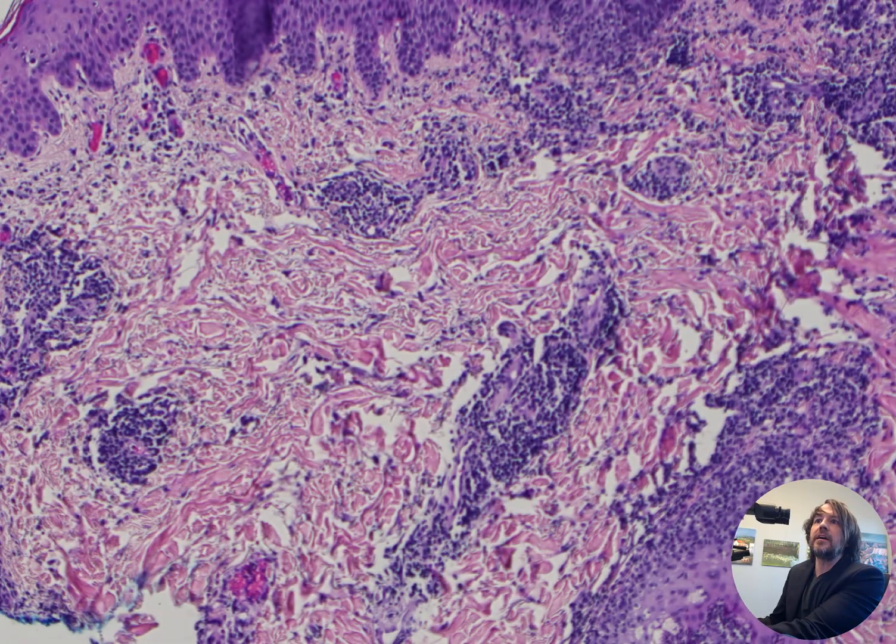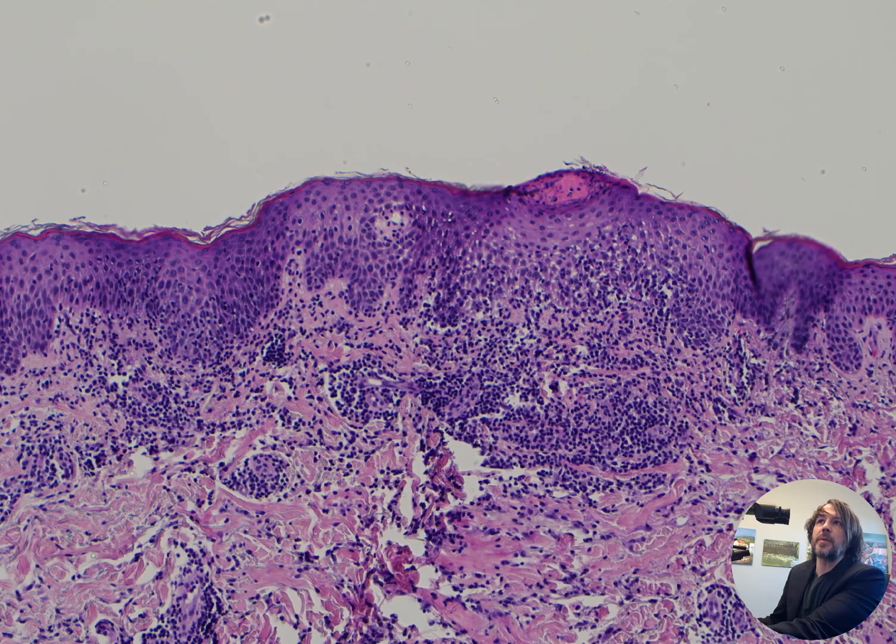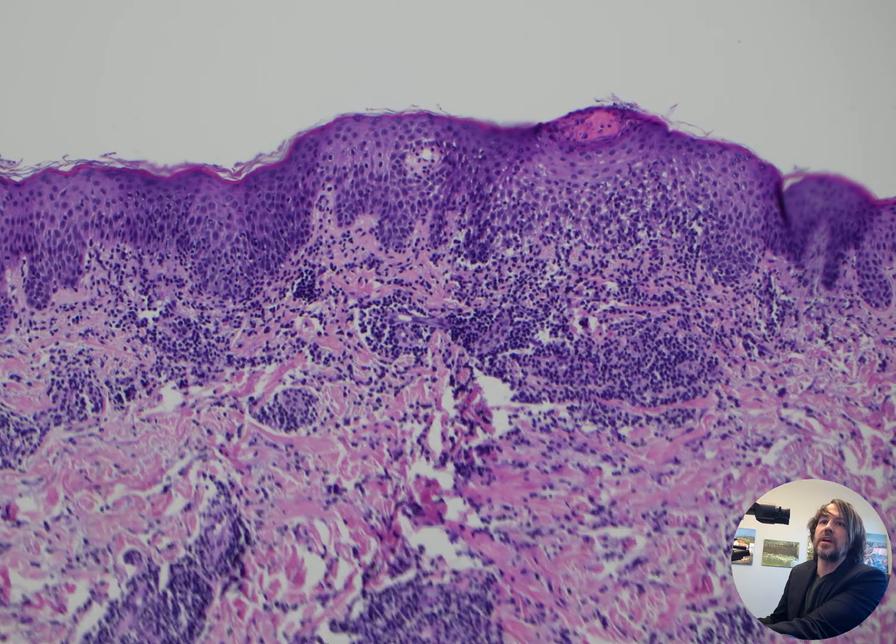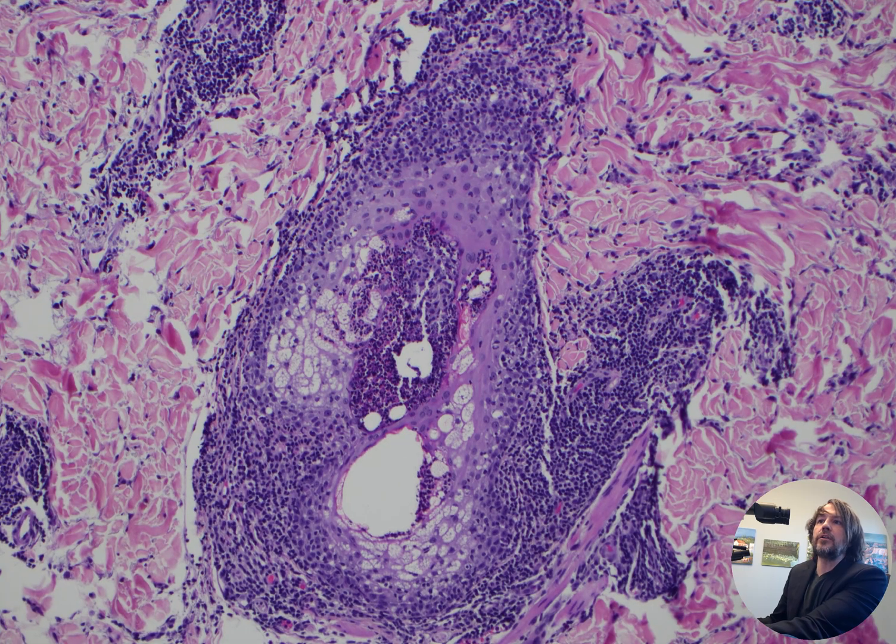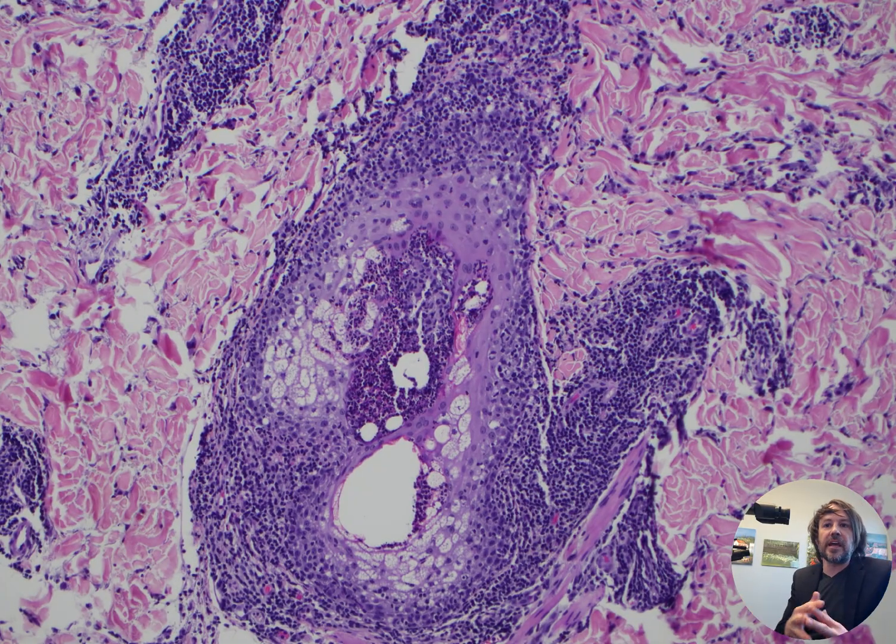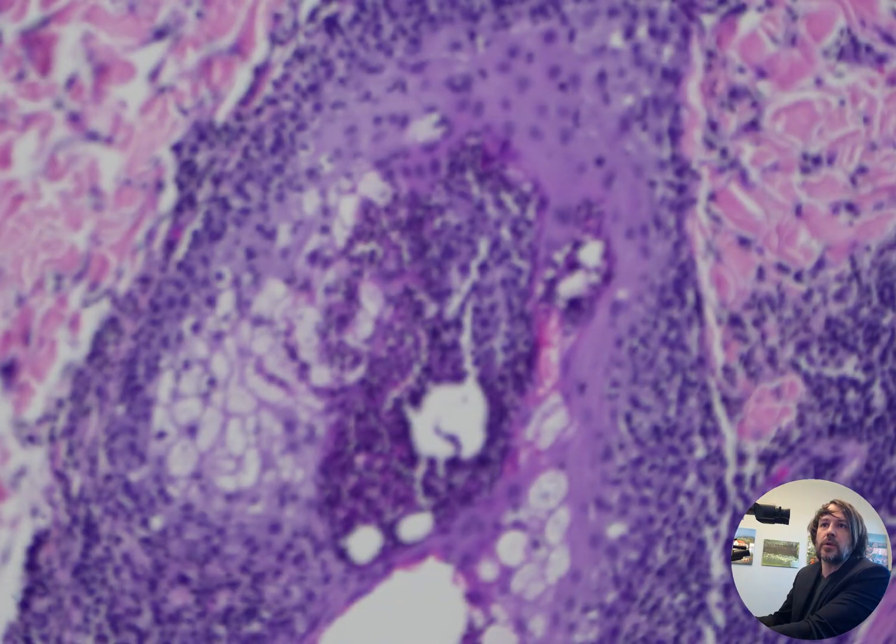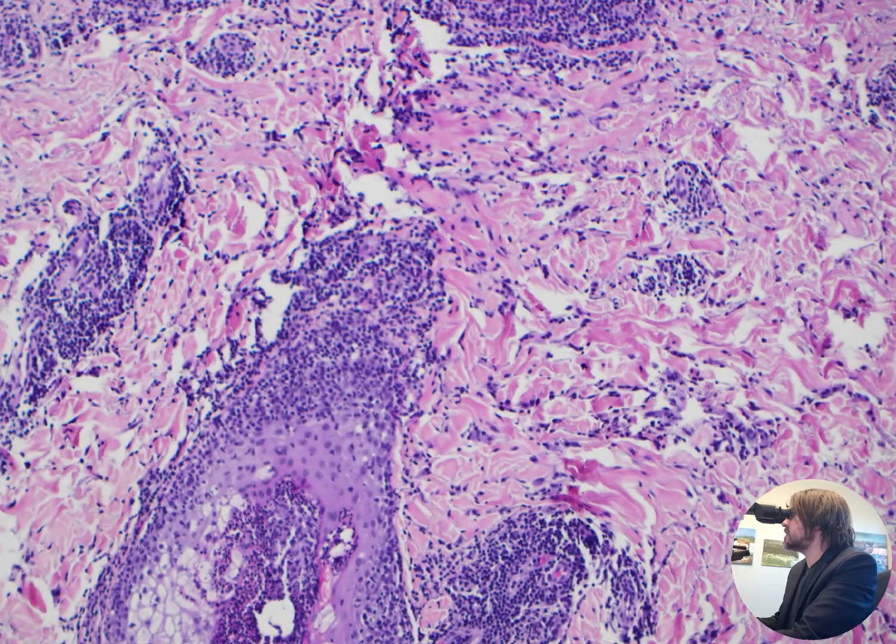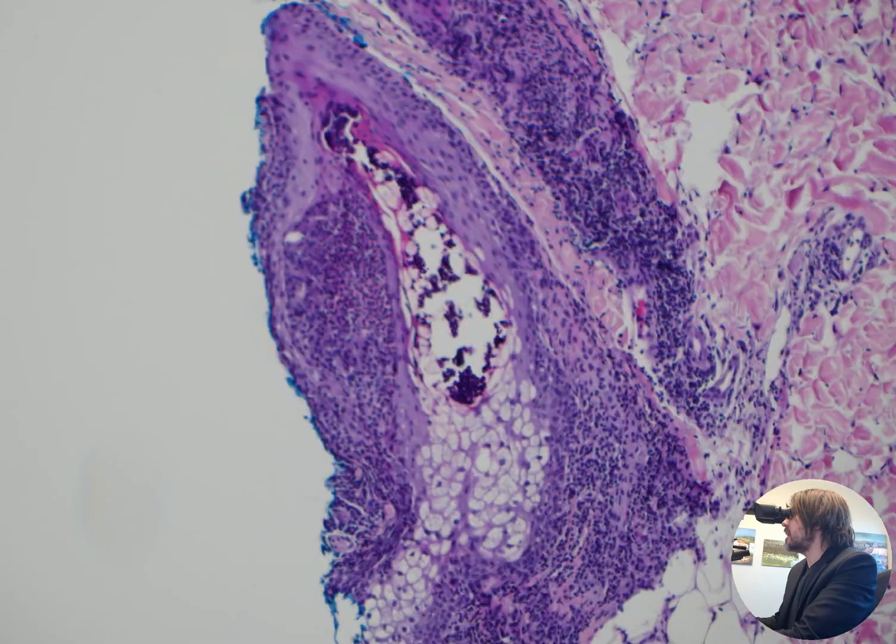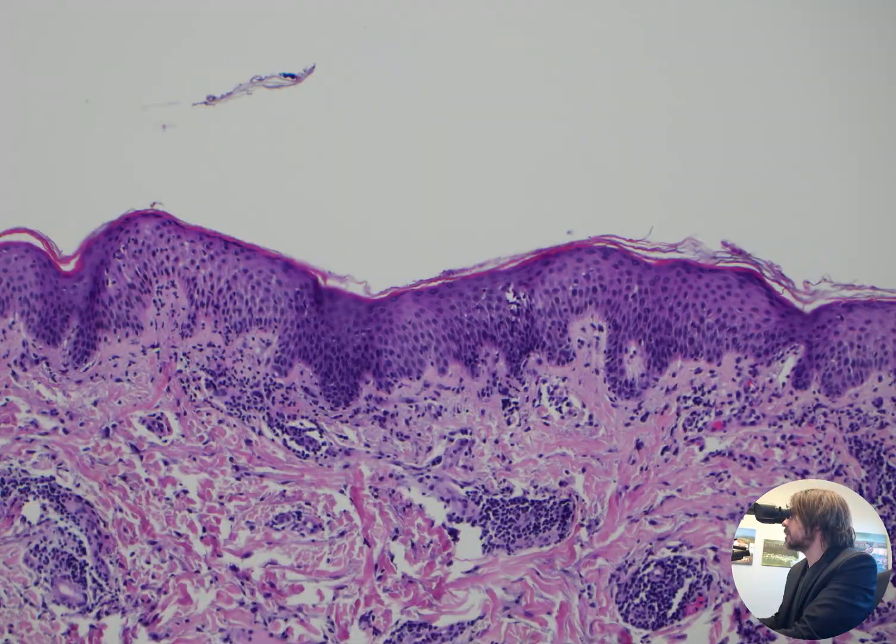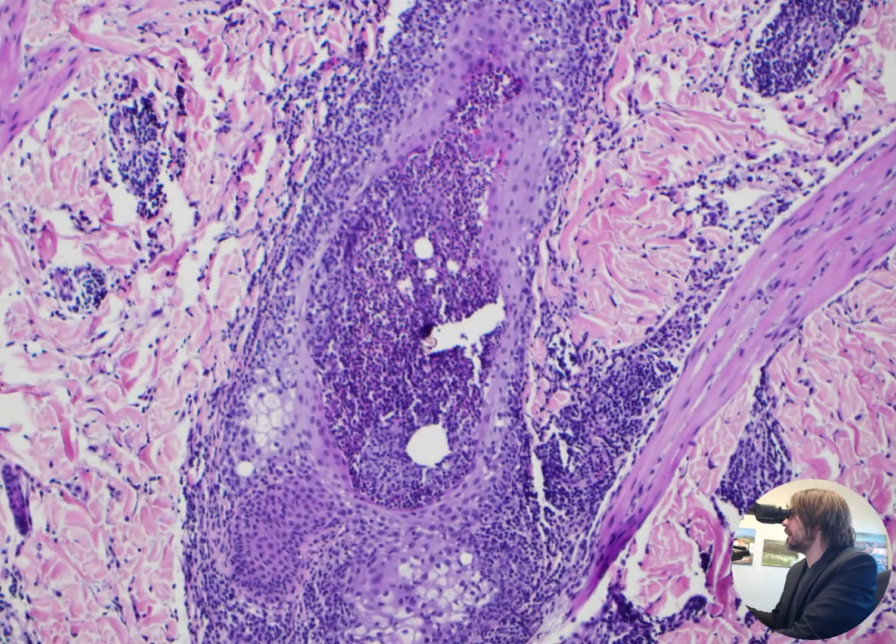So looking deeper, you can see zoster with this kind of inflammation, but I didn't see any herpes viral cytopathic effect when I looked here. But zoster often does get brisk inflammation around hair follicles and sebaceous glands, usually with necrosis of the sebaceous gland. Zoster can also get a lot of inflammation, lichenoid inflammation, spongiosis, epidermal ulceration, and necrosis. So sometimes you can see all of those things without actually seeing the viral cytopathic effect of herpes.